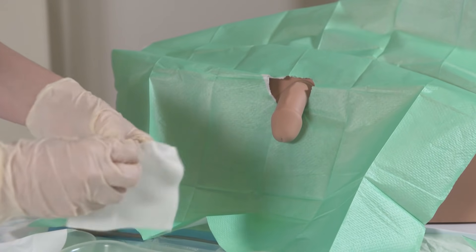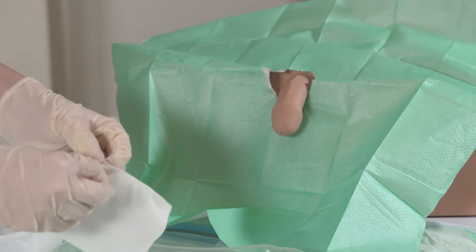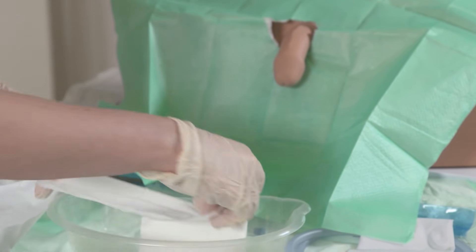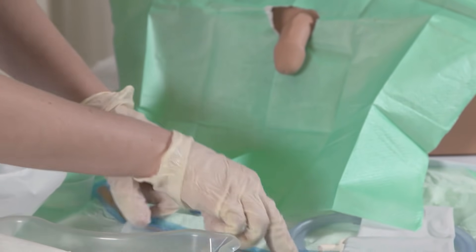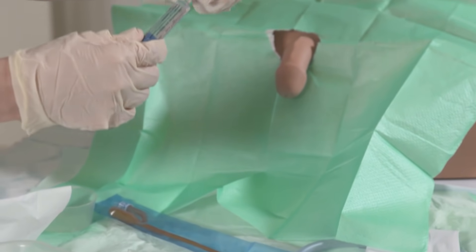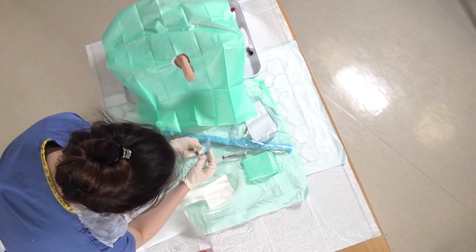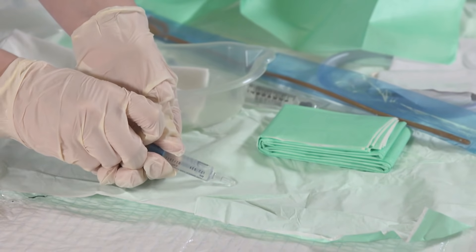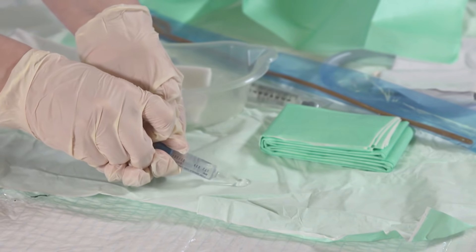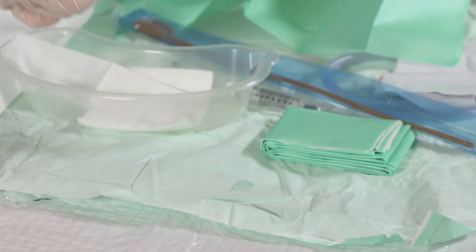Then we're going to make another sling with our gauze and get our catheter ready. The next thing we need to do is put some instiller gel into the urethra, so I'm going to squeeze a small amount out onto the sterile field to begin with, which we'll use to dip the tip of the catheter in.